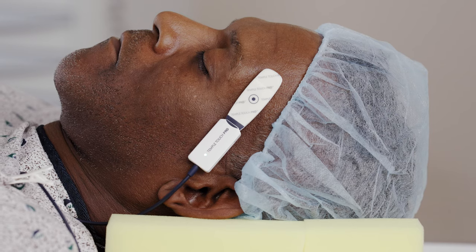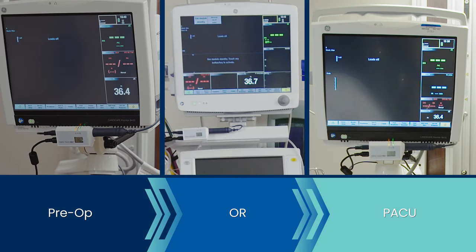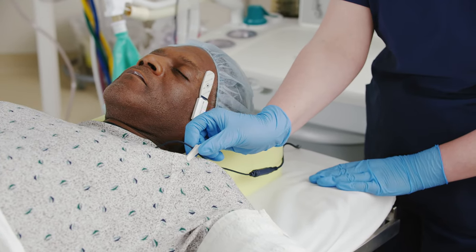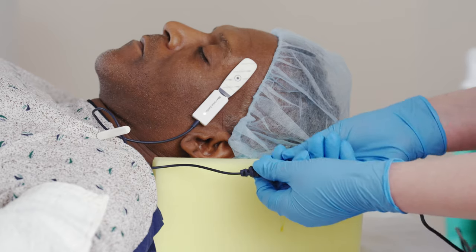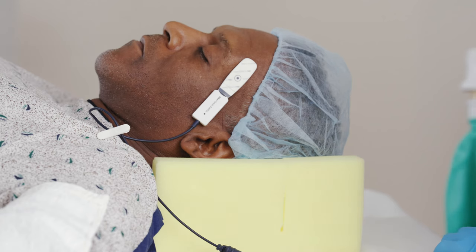The Temple Touch Pro system allows for quick disconnection and reconnection to multiple monitors. Prior to disconnecting, ensure the connecting cable is secured to the patient's gown. Then disconnect the breakaway cable, making sure the sensor stays connected and adhered to the patient's temple during transport.